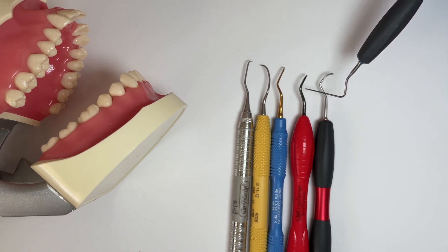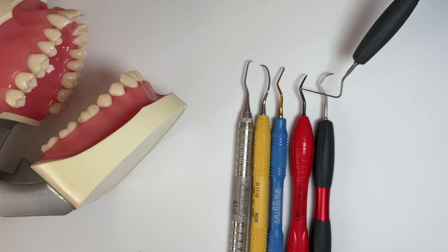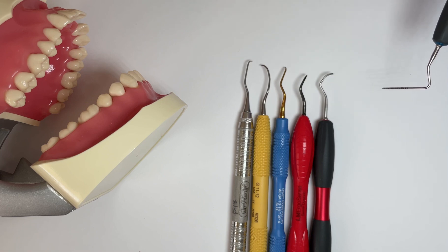The other thing to discuss on the shank is what's called the lower or terminal shank. This terminal shank area runs from the working end heel all the way to the very first bend. That's called our lower or terminal shank, and it's important because it helps us orient our instruments to the tooth surface.